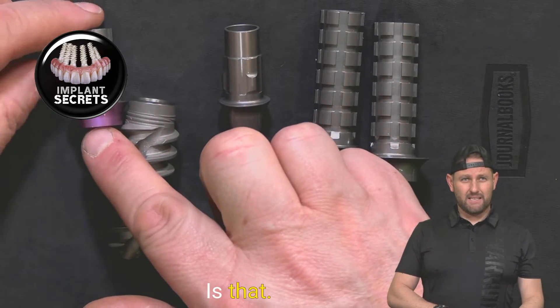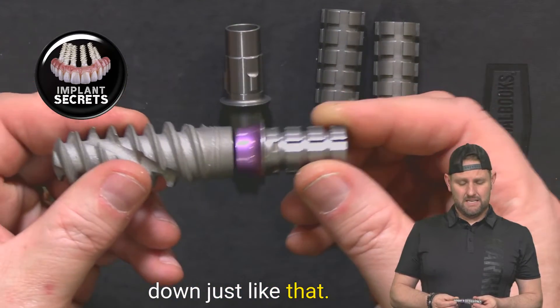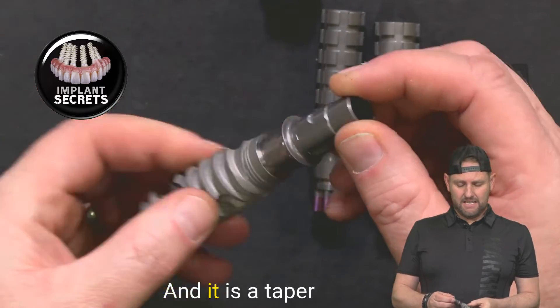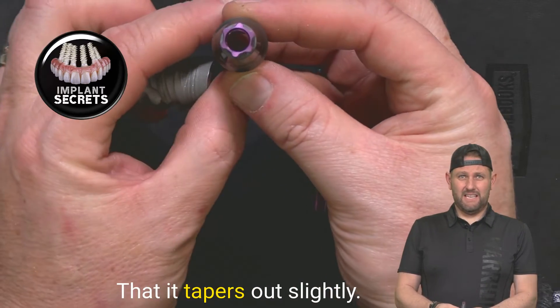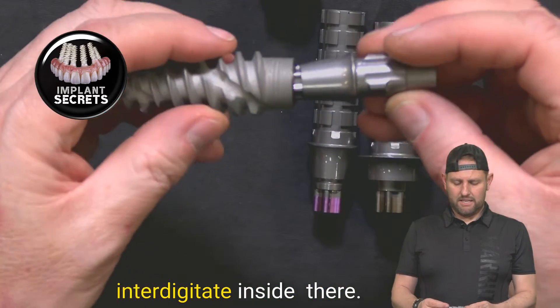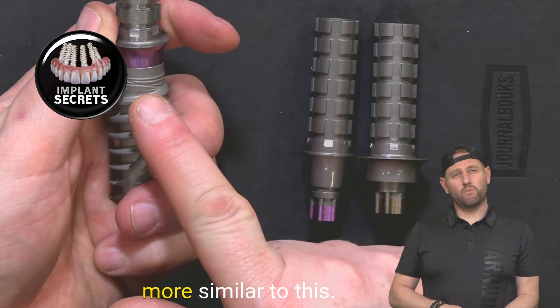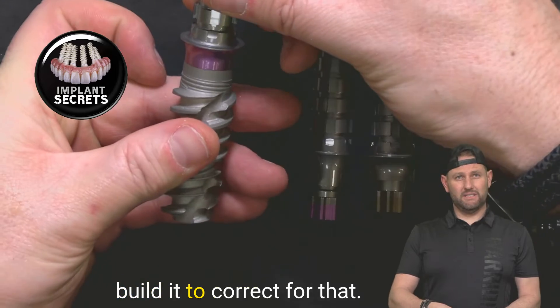This here is what we call a non-indexing abutment, meaning it doesn't index into the implant — it just attaches down like that. Versus this one here, where you actually see it index in — it locks in with a taper going inward, and there are hexes that interdigitate inside. So it really locks in. This indexing type is better for a single implant. If we're doing a bridge, then we need something more similar to the non-indexing, because implants aren't always perfectly parallel and this allows us to correct for that.